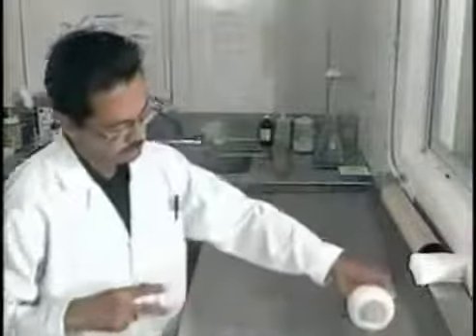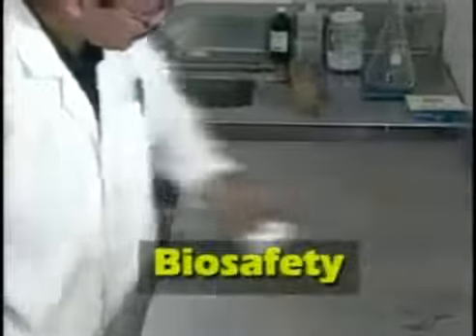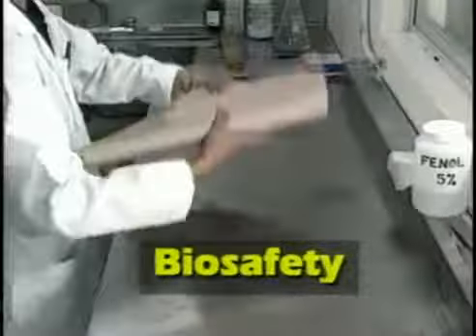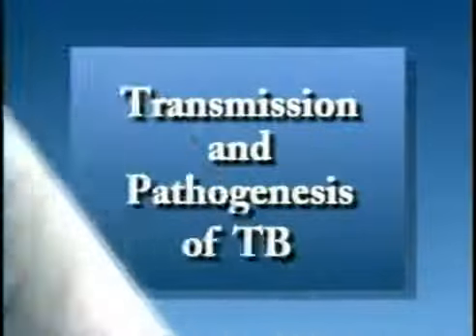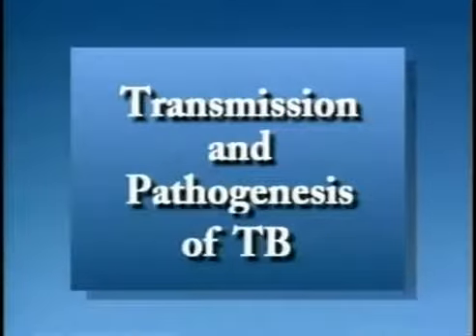There are many facets to the process of smear microscopy. First, let's discuss biosafety. Working with TB requires care and special precautions. A brief review of the mode of transmission will highlight the dangers in working with this microbe.